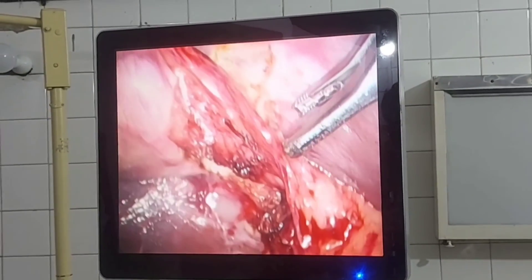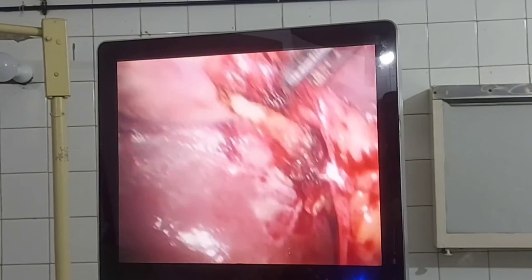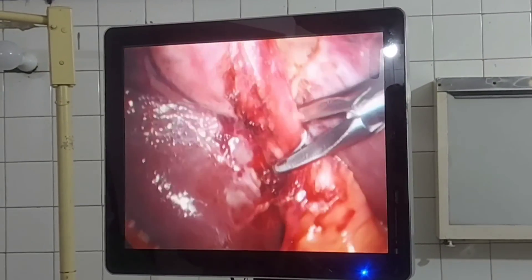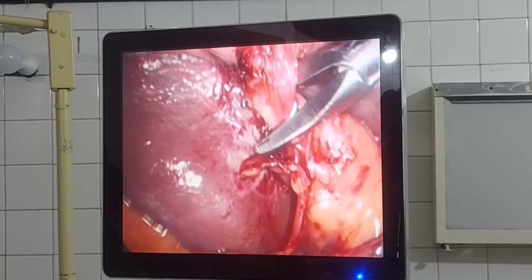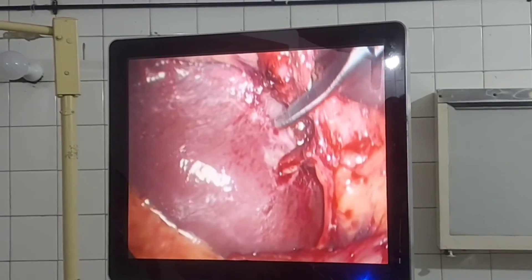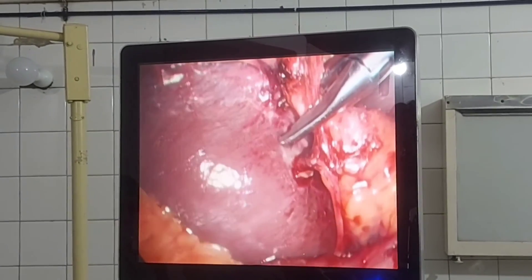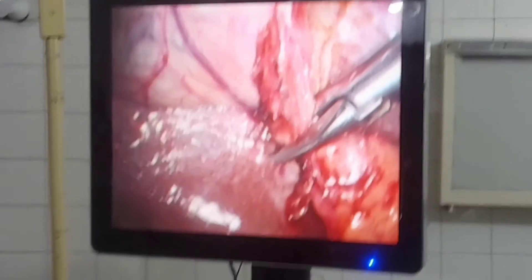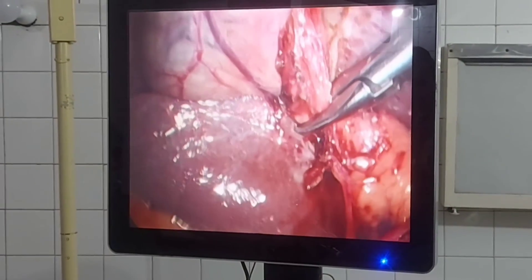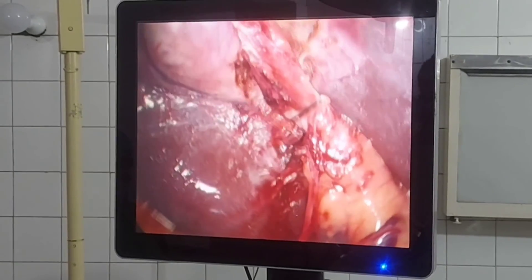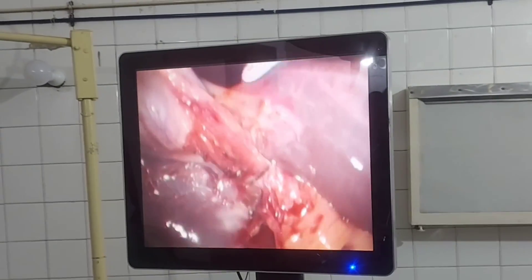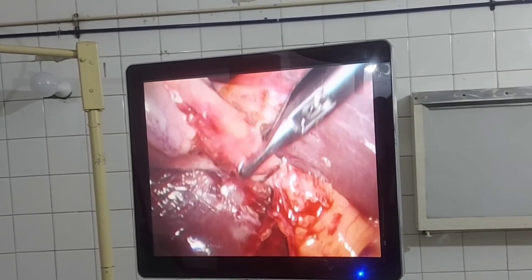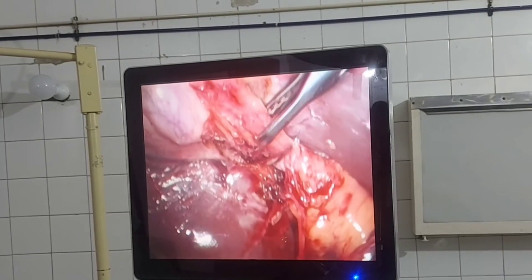When absolutely satisfied about the anatomy and critical view of safety, metal clips are applied — two on the proximal side of the cystic duct and one toward the distal side. There are different sizes of cartridges for these metal clips, used according to the size of the structure.